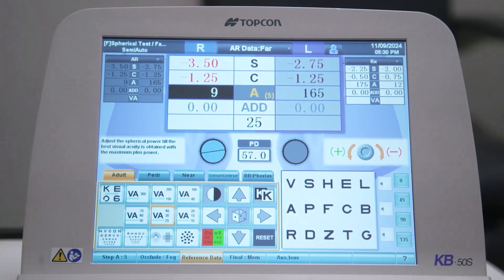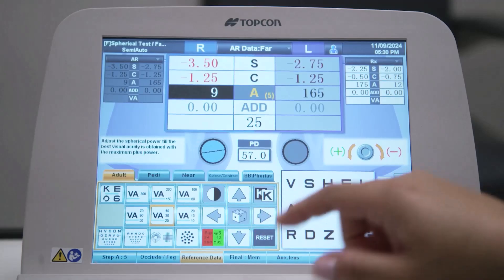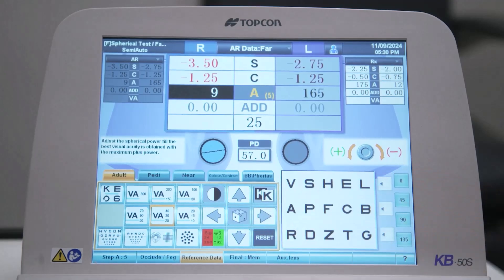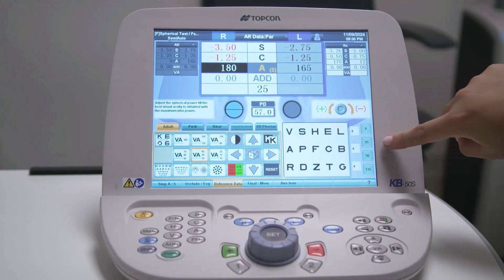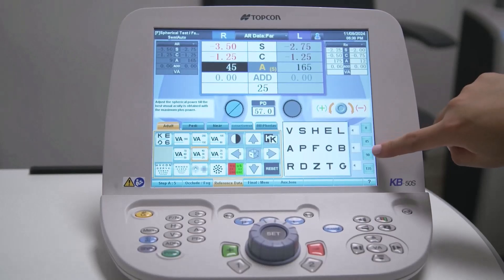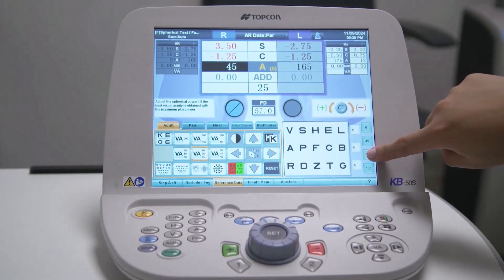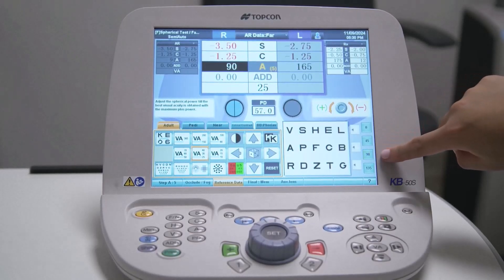These options change for other charts. For example, when checking the cylinder axis, the axis values are displayed in 45-degree increments. Selecting one of these values will move the axis to that degree.